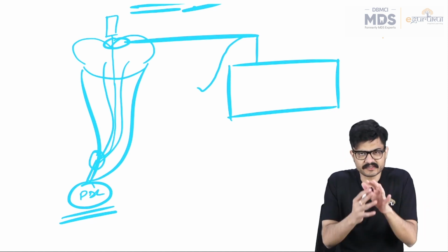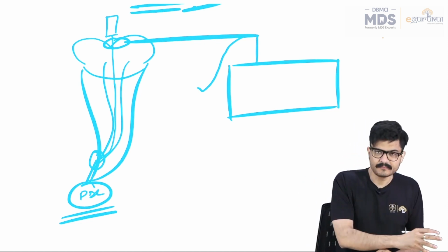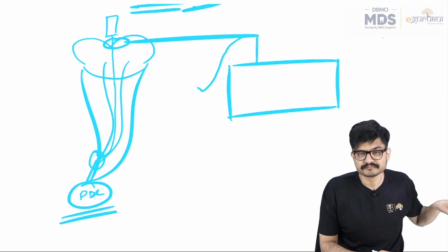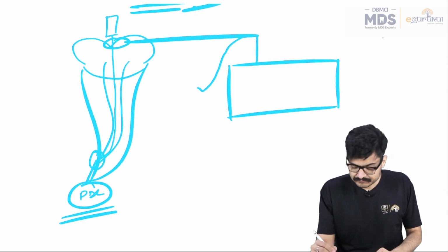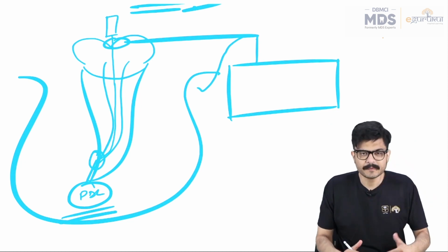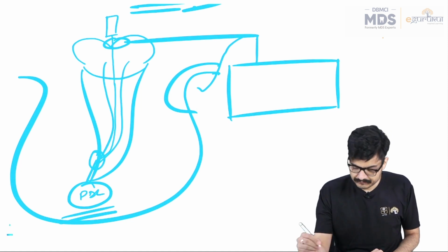Whatever. The electric circuit has to be complete, right? So on one end, it is connected to the file or the reamer, which has gone deep inside the root canal to just beyond the apical constriction, right? And the other electrode is in contact with, for example, the buccal mucosa. So this is a cross section of the oral cavity. That's my buccal mucosa, that's my tooth. So this electrode is in contact with the buccal mucosa.